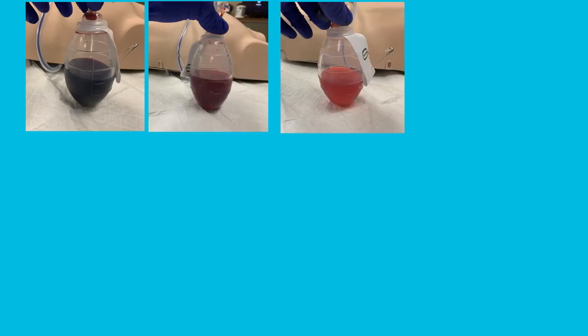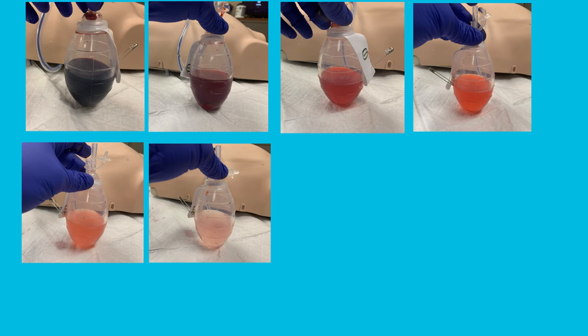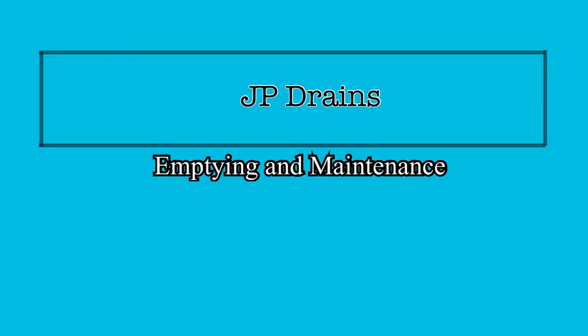Over time, the color of the drainage should change — it should become lighter in color as the patient heals. It should also be yielding less drainage as the patient heals, so you should see the output trending down over time. If you ever notice a darkening of fluid or an increase in total drainage output, contact the physician immediately. Remember to empty the drain at least every four hours, and any time it is at least half filled with drainage, or whenever you think it is appropriate.